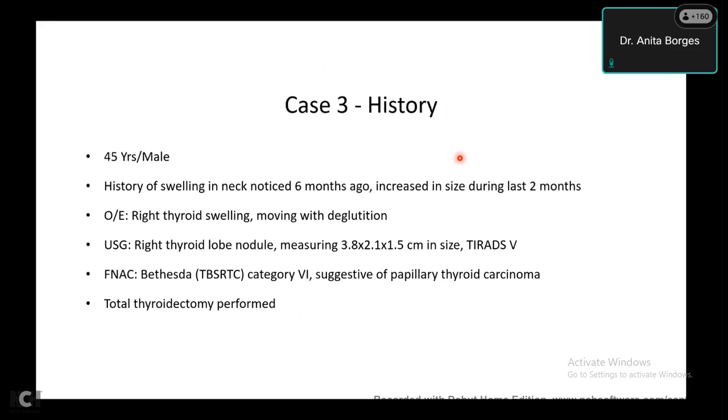I'm sometimes forced to give that. But I think if you look carefully enough, you will begin to see papillae in this kind of tumor. Theoretically, I have never seen it. Yes, have you seen it, Swapnil? Sometimes the situation arises, but essentially, as you said, most of the time we find enough papillae somewhere or the other to actually call it PTC. But I think sometimes people get confused with that. Yeah, I would look very carefully for papillae.